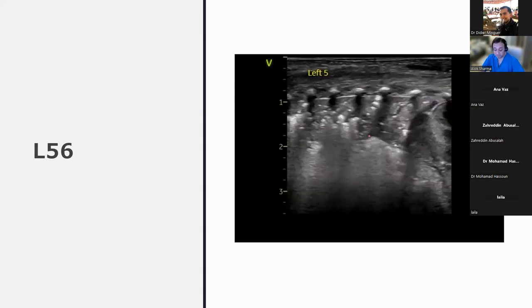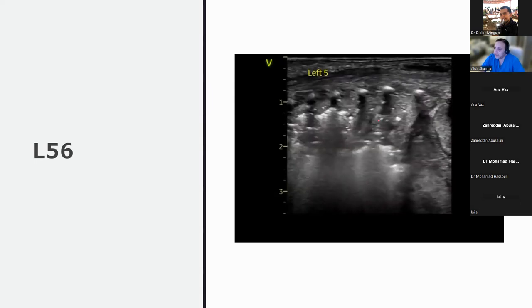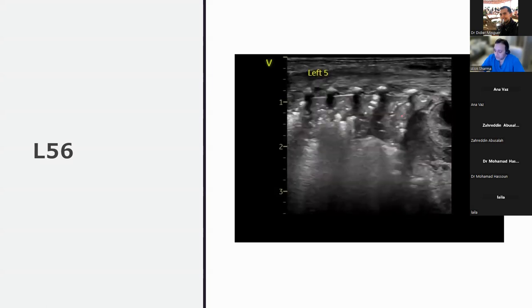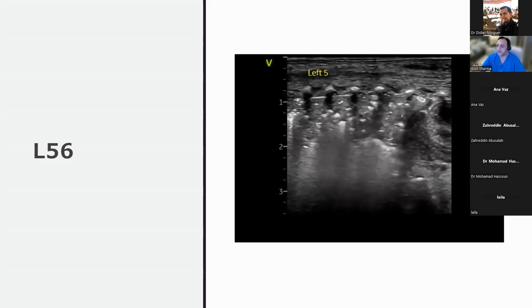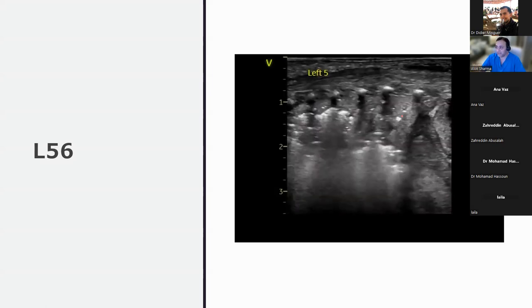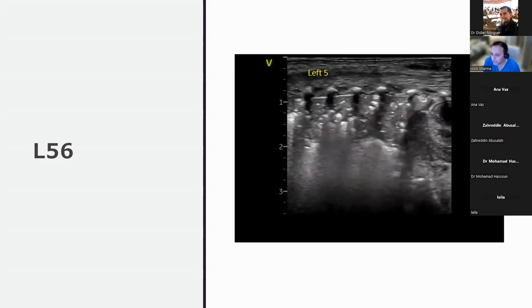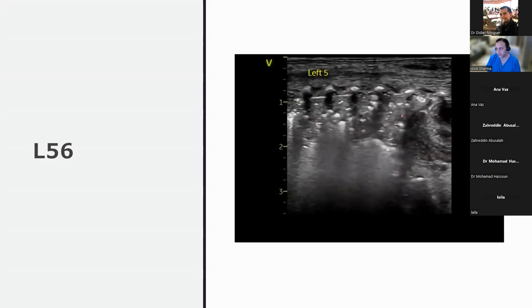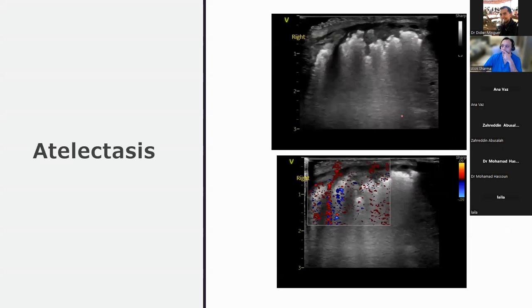So again, putting a Doppler here would be really helpful. I haven't done it in this particular case. But these are regions of lung that you might be able to recruit. So remember, your baby's supine with bad chronic lung disease and is desaturating. And really, it's often the posterior zones of the lung that are really poorly recruited. And that is one of the reasons why proning in these babies really helps. Yeah. So it's really, really important.